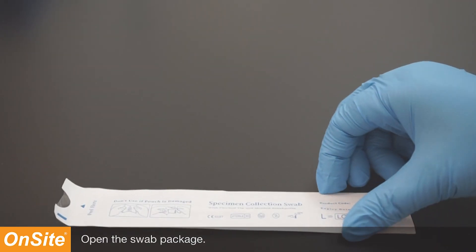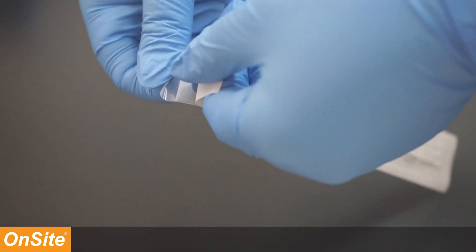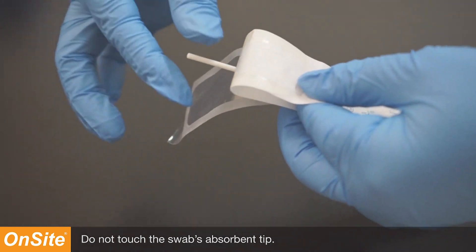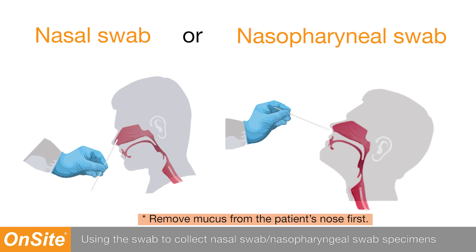Open the swab package. Do not touch the swab's absorbent tip. Use the swab to collect nasal swab or nasopharyngeal swab specimens.